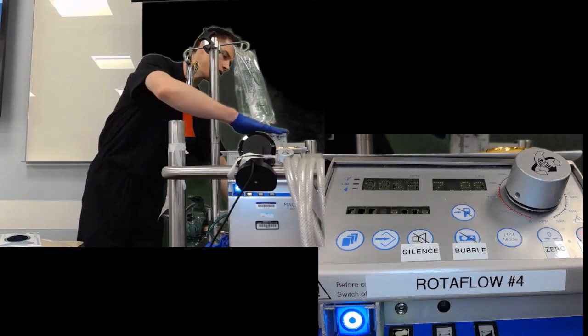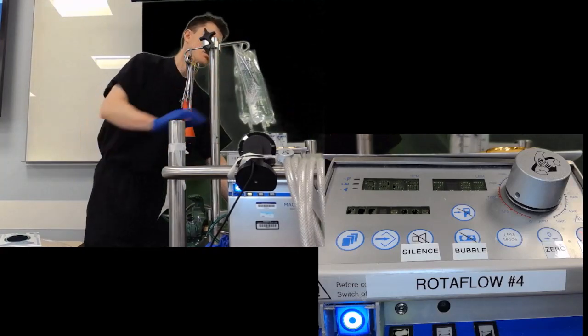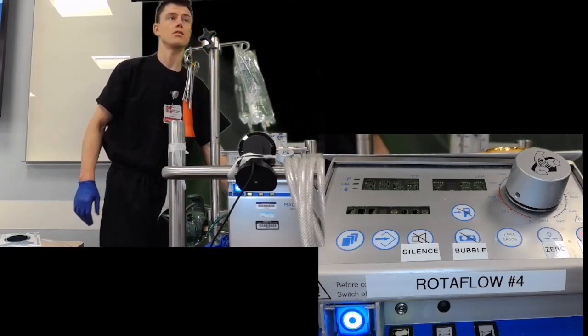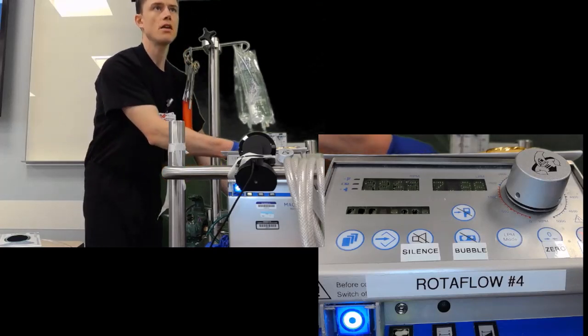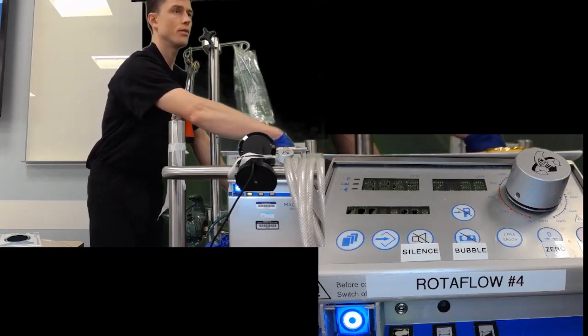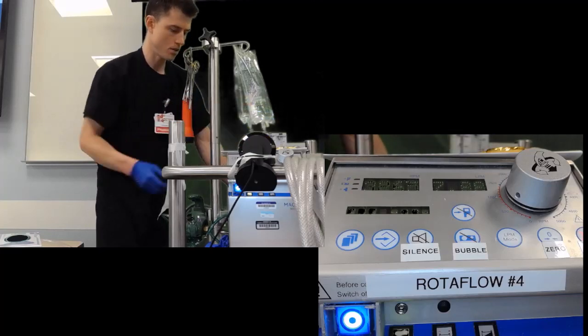What else about this are you looking at to make sure that even if you turned it up to 100%, what do you want to see on this gas meter? You want to see some sweep gas going, right? So right now we're not hooked up to wall oxygen, so it says 0. But if you saw that as 0 and you're hooked up to wall oxygen, it means that you've turned it off. So you actually need to turn the dial to get actual oxygen going through the oxygenator.